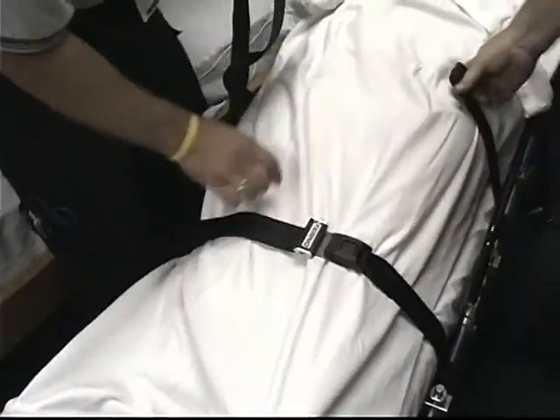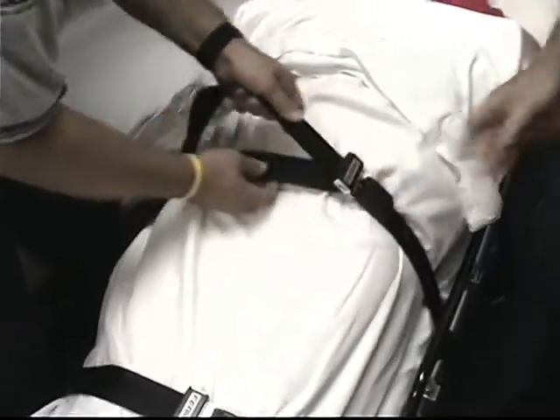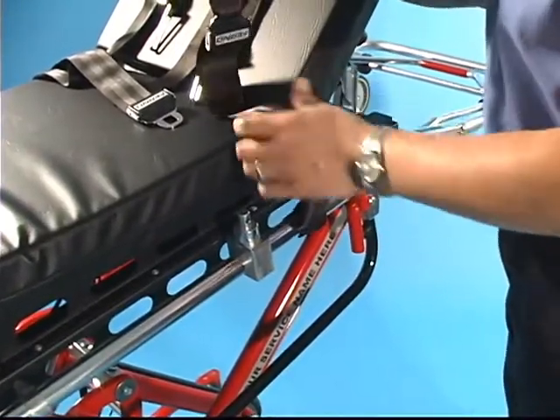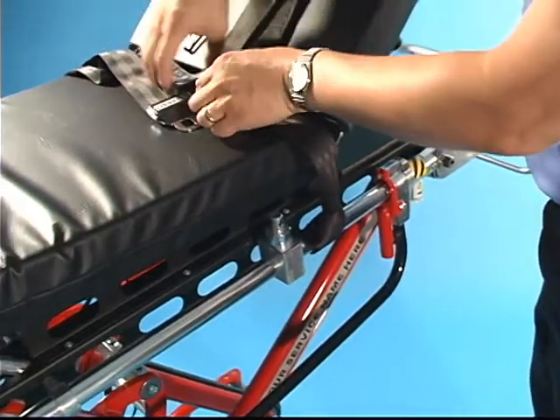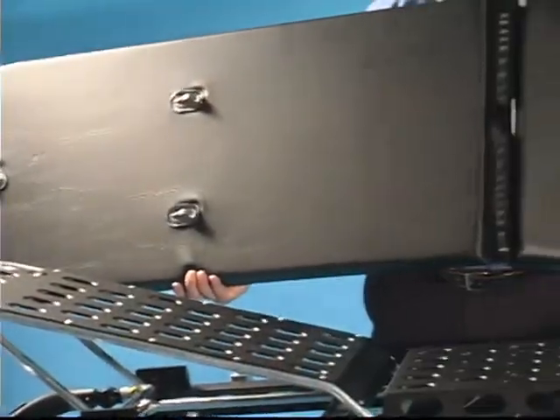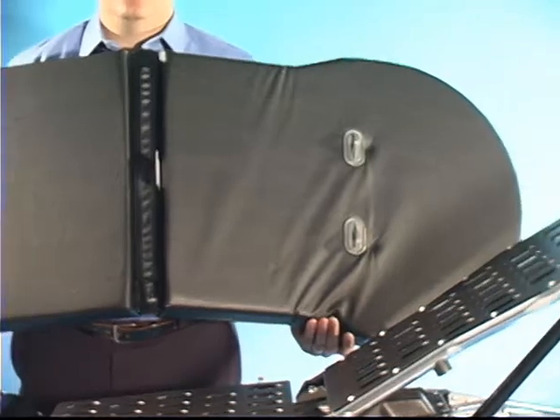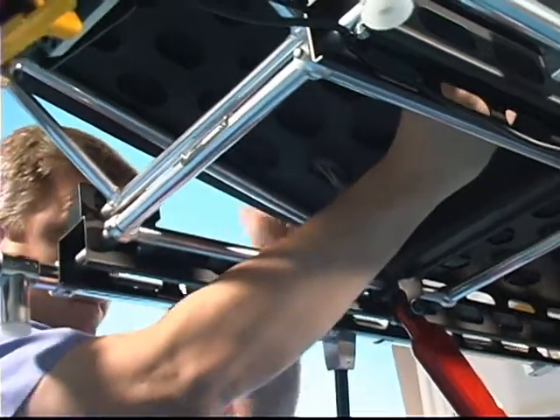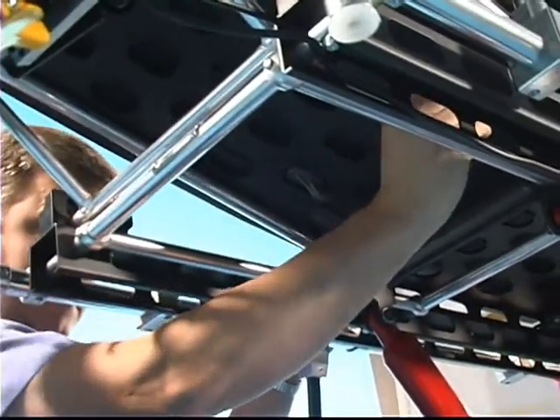Use all three restraints provided with the cot to secure the patient on the cot. To attach, use, and maintain restraints, see the supplied restraint user's manual. The PowerFlex includes a locking mattress with five hooks on the bottom to anchor the mattress to the cot and limit its movement. Be sure all five hooks are properly secured through the holes in the bed panels.